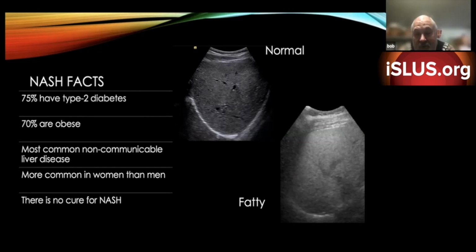This was all our old grayscale ways. Before we had elastography, this is the only way we could do it, so it was subjective to the person reading the ultrasound. The two things we really looked for were how far could we get to the diaphragm, because sometimes we would lose the ultrasound beam a centimeter or two above the diaphragm and never see it, and how well are we seeing vessels inside the liver? Sometimes we don't see anything at all.